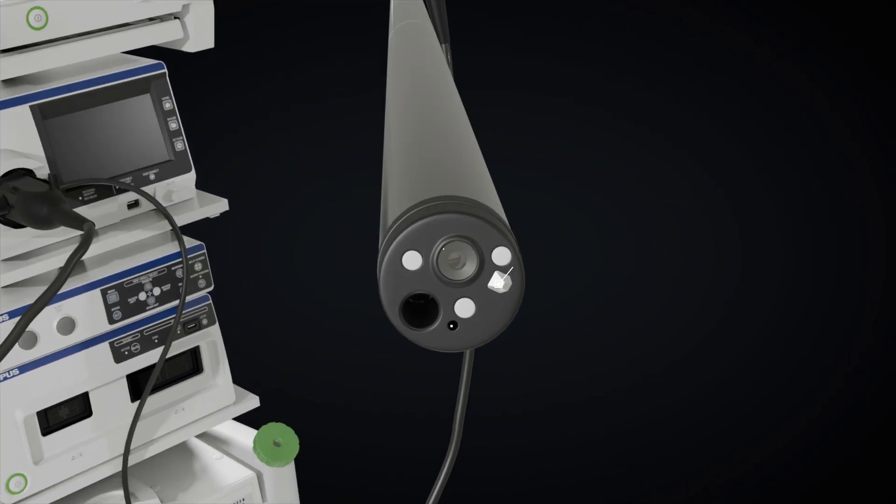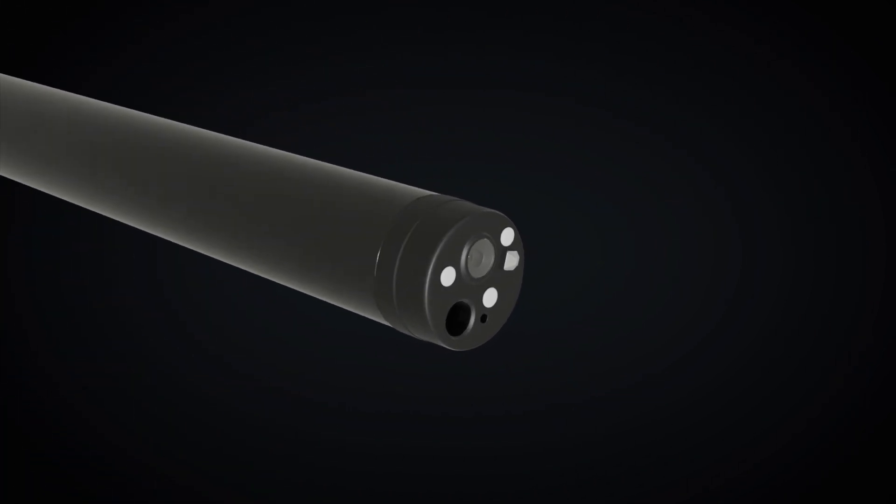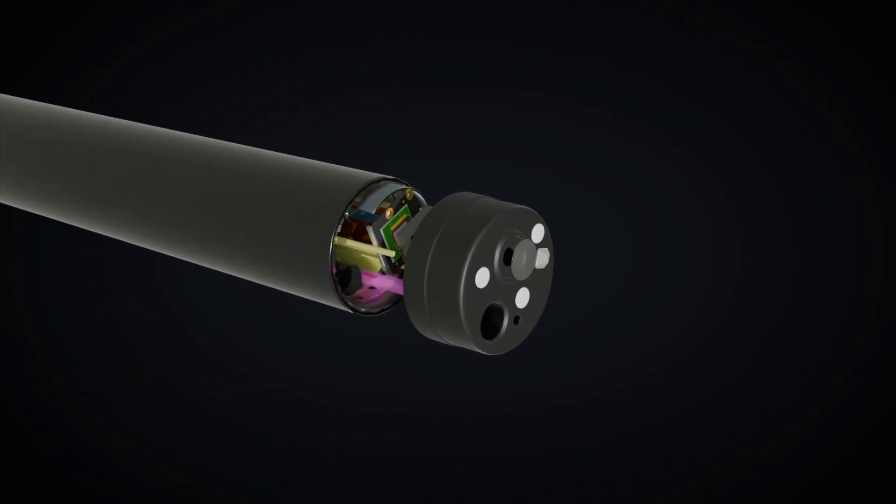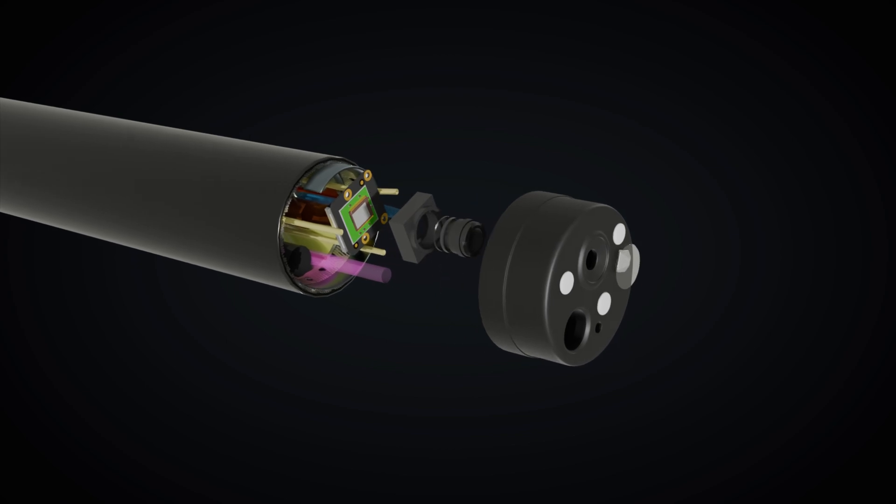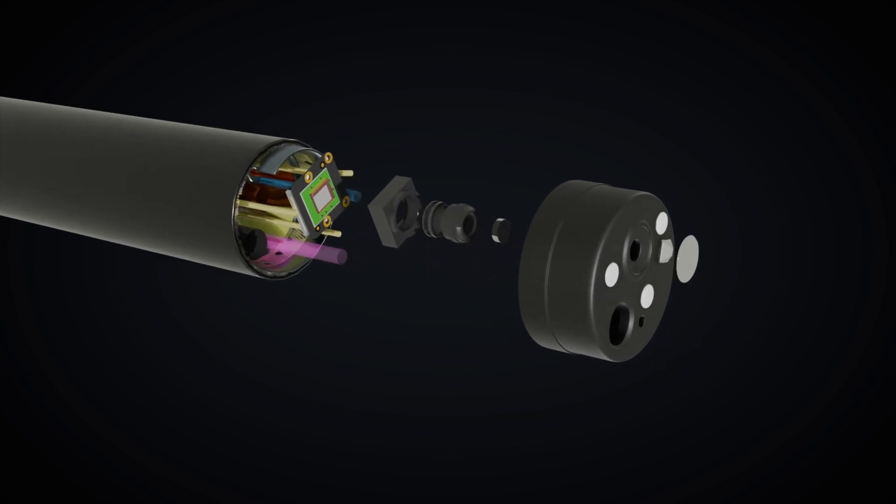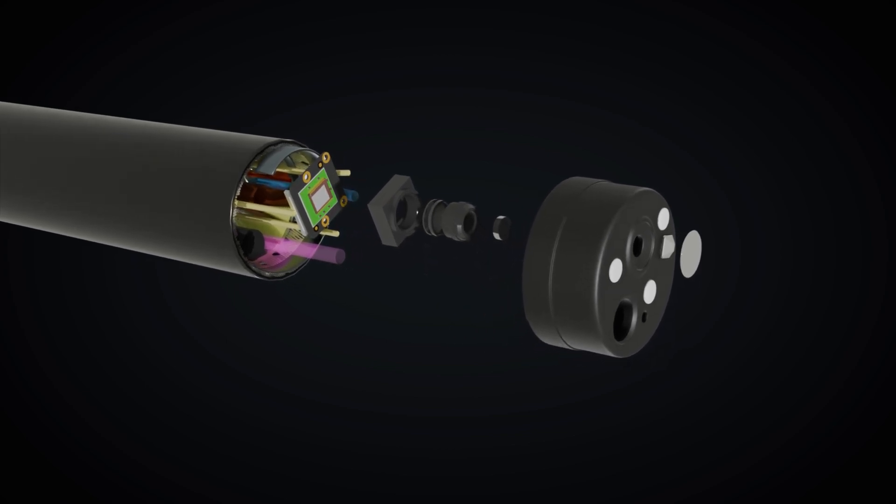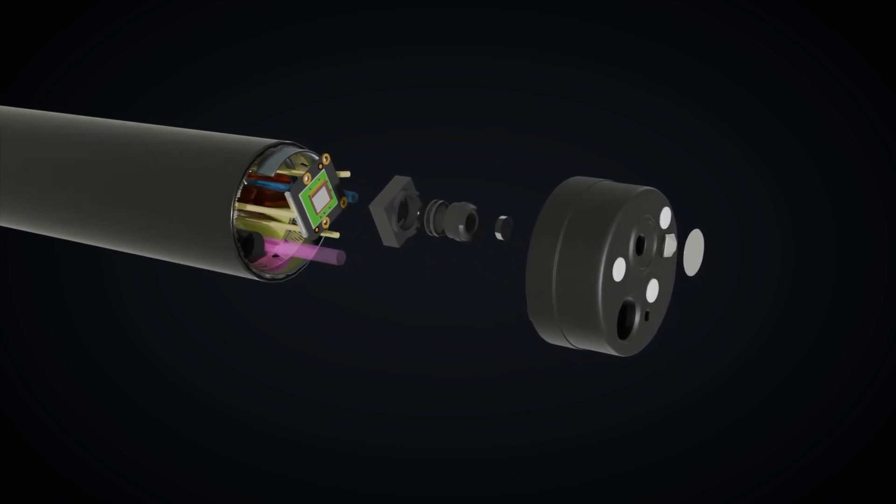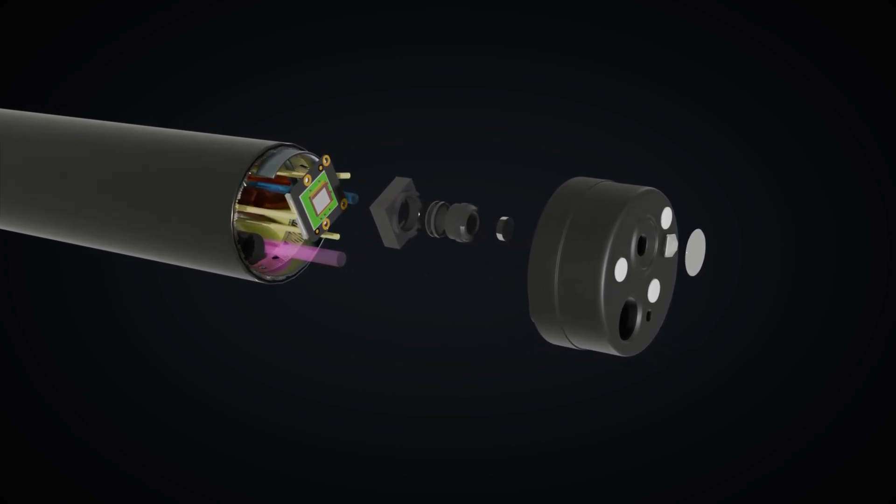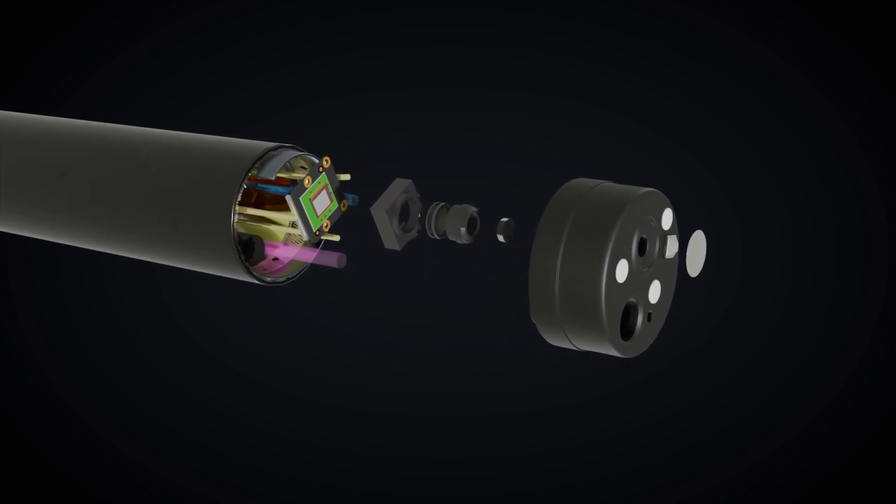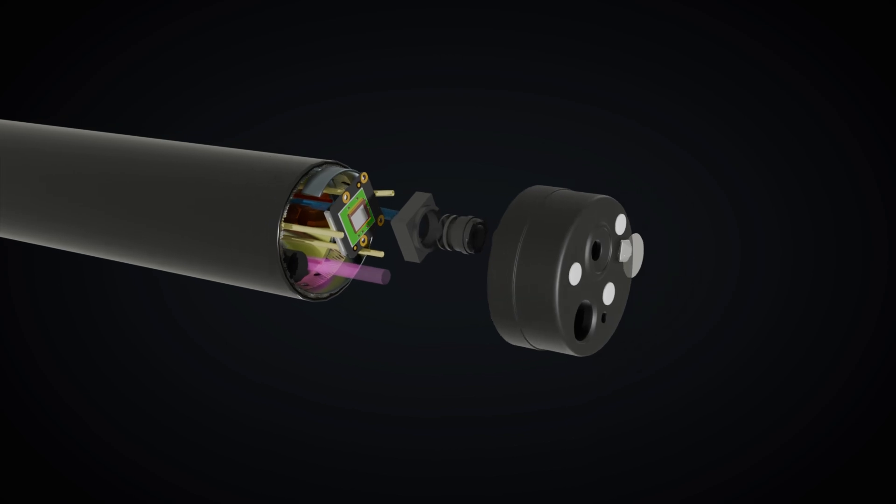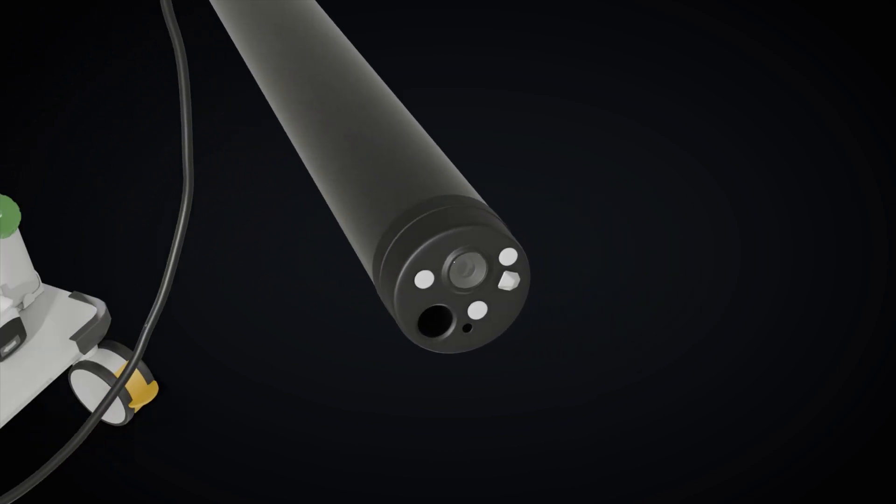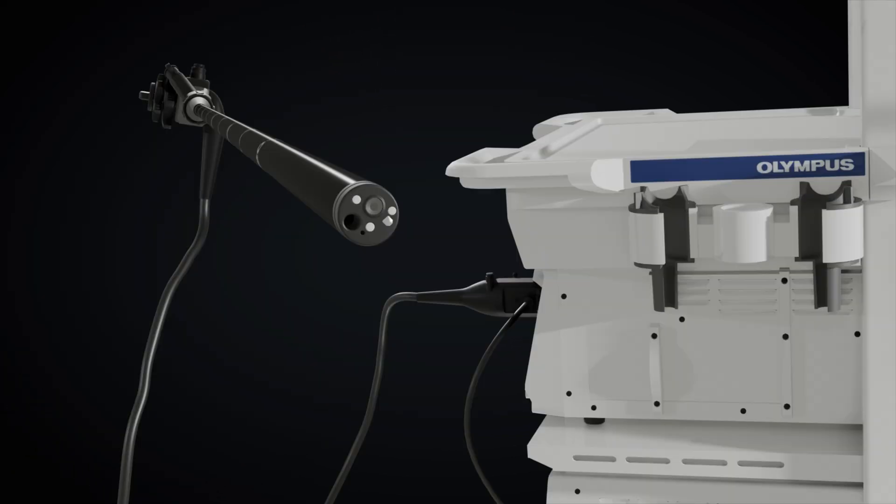The objective lens typically employs a super-wide-angle design to capture extensive tissue areas at once. Some endoscopes feature an optical zoom function for detailed tumor examination.